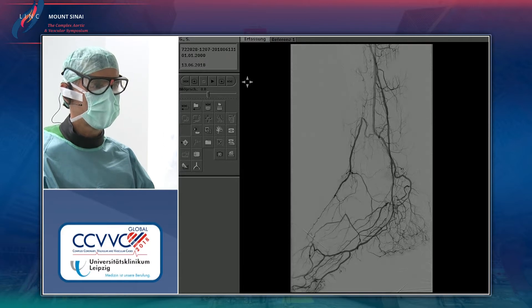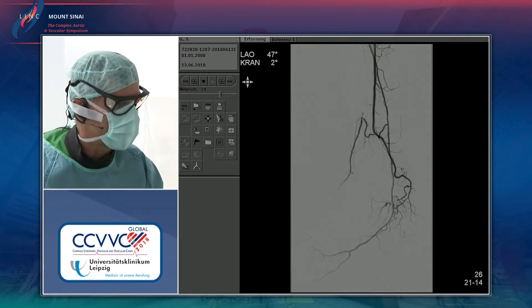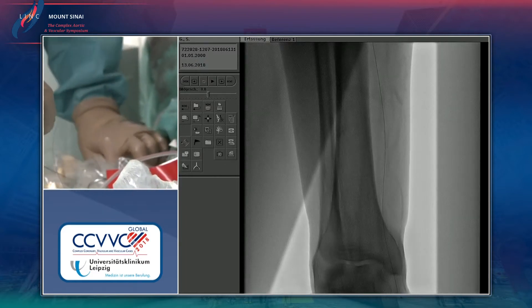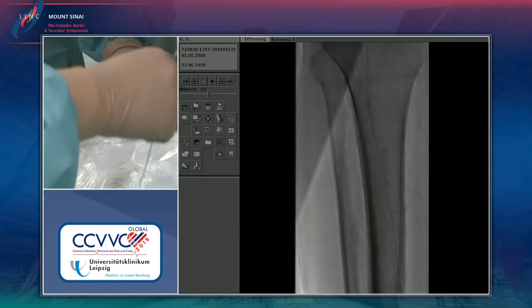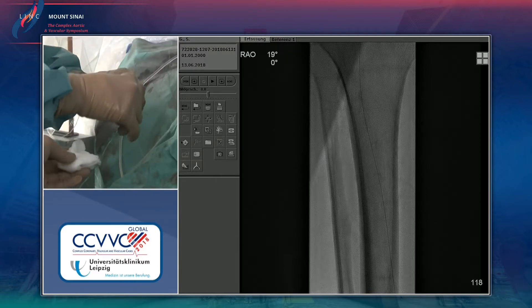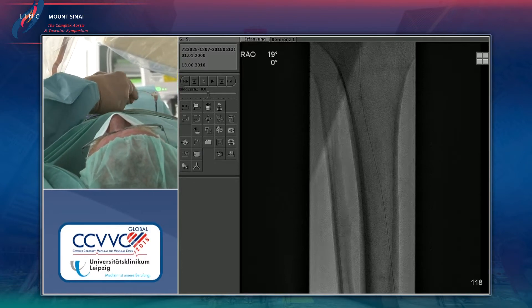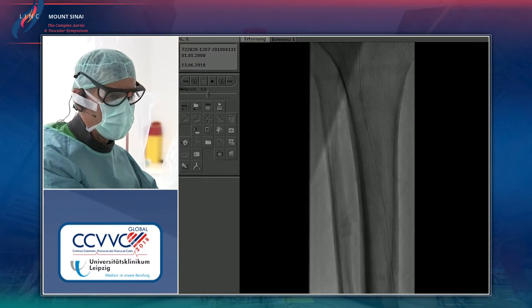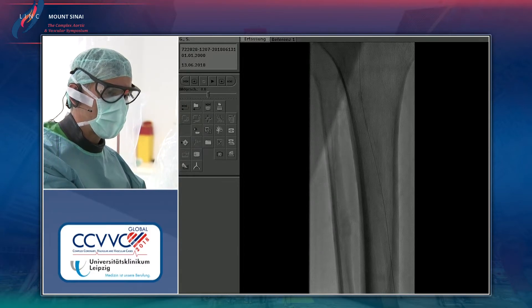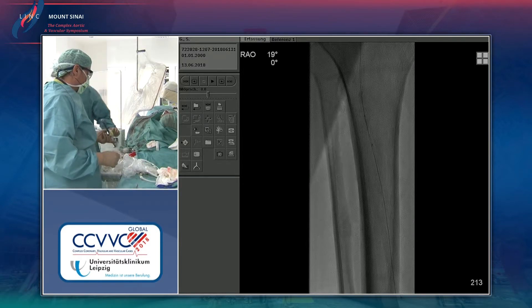Flow is a little faster but not yet optimal, and forefoot filling looks good. However, the proximal stenosis still needs to be resolved. One option being considered is implanting a short stent from the tibiopopliteal trunk into the posterior tibial artery and then dilating through the mesh into the peroneal — this typically does not cause jailing of the peroneal. The other option remains using a focal force balloon.